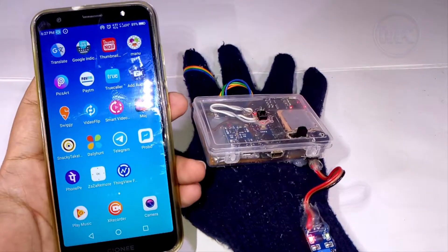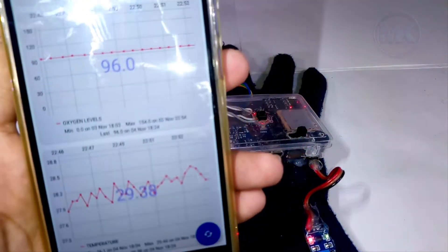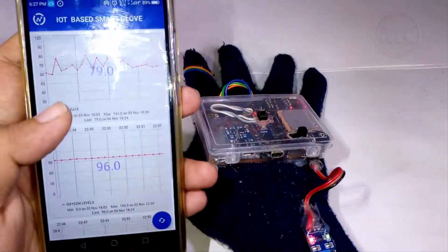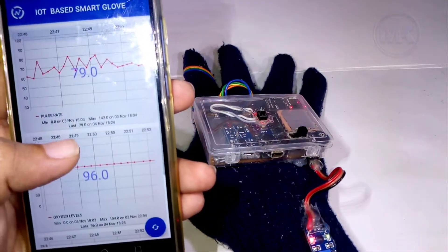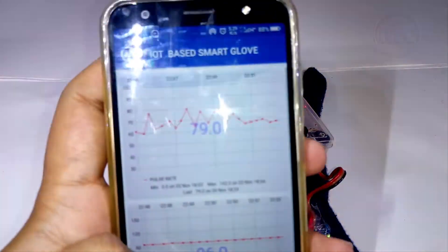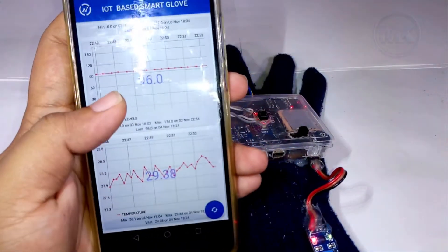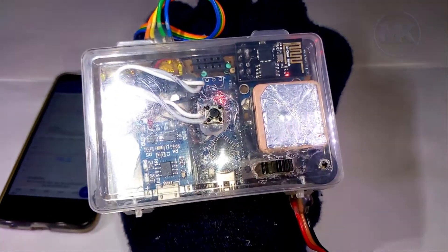This glove will send the measured values to the ThingSpeak IoT platform, and we can see those values on mobile. These are the graphs of each health parameter like temperature, pulse rate, and oxygen levels in blood. These graph values will be updated every one minute, so a new value will be added to the graphs every minute.